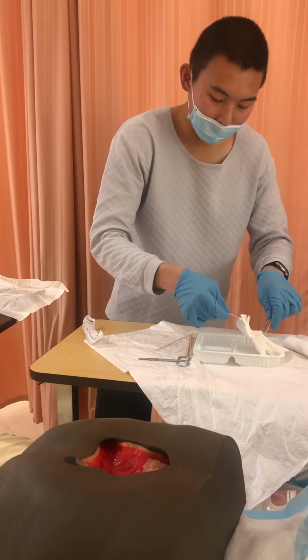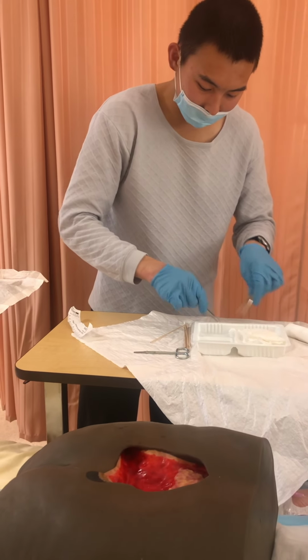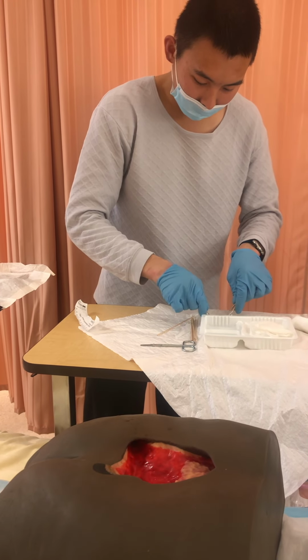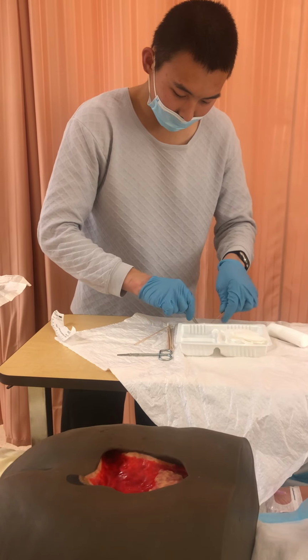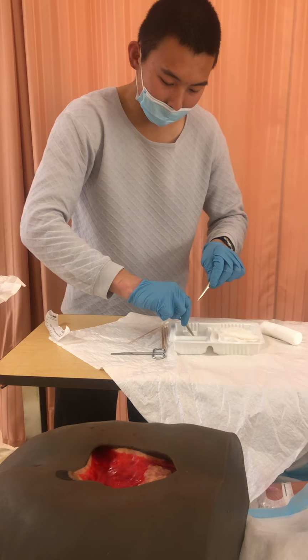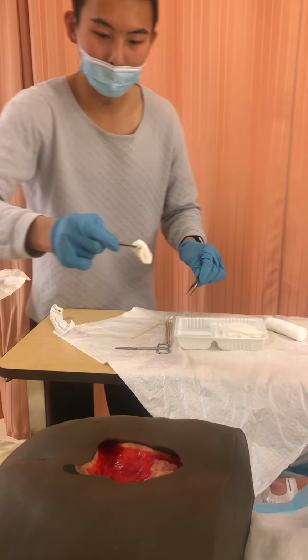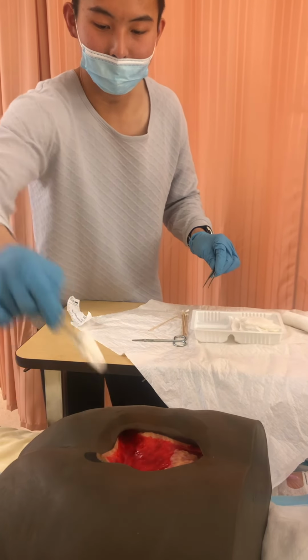normal saline to wipe the peri-wound skin. So I'm gonna get my first 2x2, I'll probably just put it here just so you can see me doing it, but measure the wound in terms of its length, so I'm going to use a Q-tip. I don't want to touch, and make it into a rosette, and I'm going to wet it and then use it to wipe the peri-wound skin. Here I'd say it's top to bottom 12 centimeters, on the left side.